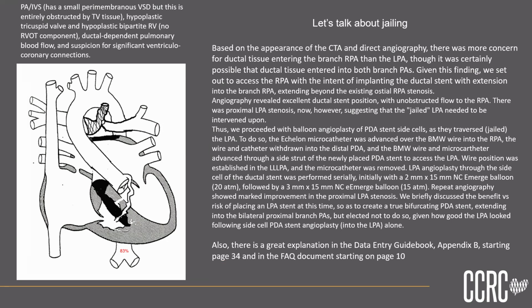If you look at this heart, you're going to guess that this kid is not going to get a 2 ventricle repair either. And if you read the echo report, it said diminutive, severely hypoplastic RV. Actually, this kid went on and had a transplant.